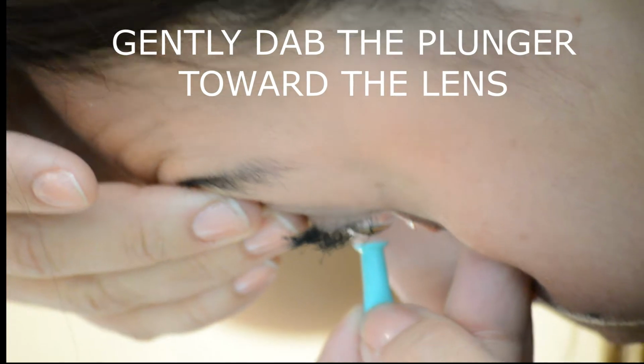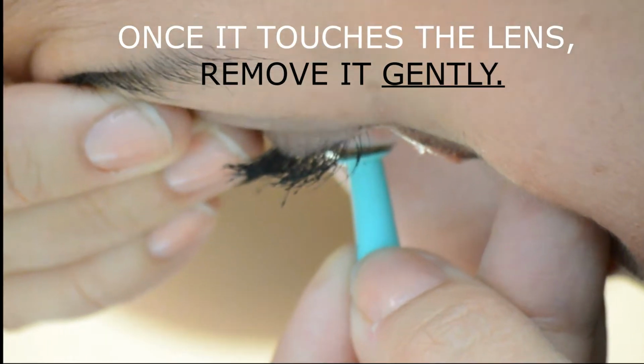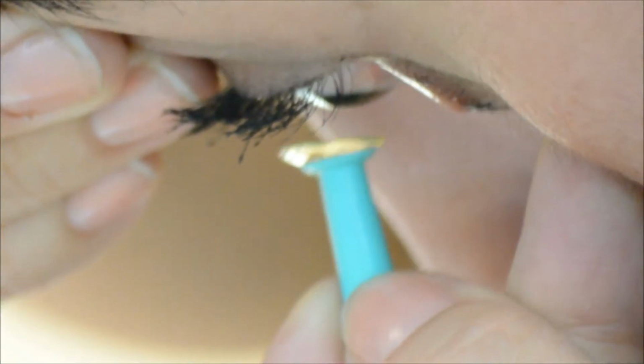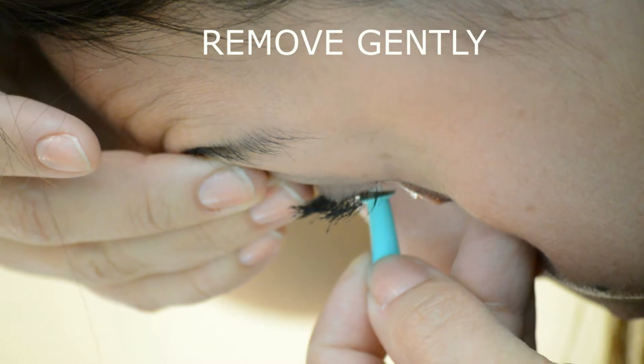Now, to remove your lens, gently dab the plunger toward the lens. Once it touches the lens, remove it gently. Again, gently dab the plunger toward the lens and remove it gently.